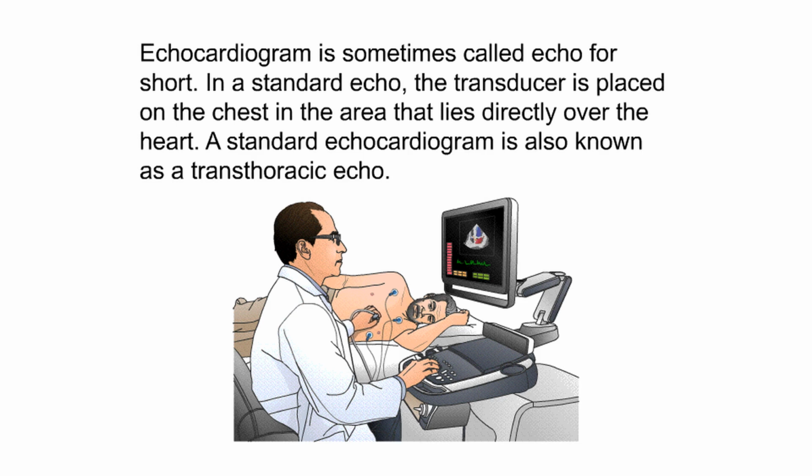Echocardiogram is sometimes called echo for short. In a standard echo, the transducer is placed on the chest in the area that lies directly over the heart. A standard echocardiogram is also known as a transthoracic echo.